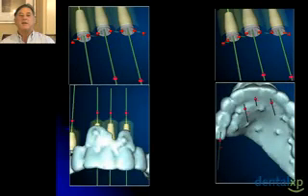In the lower left, you see 3 implants well positioned in these 3 anterior teeth. If we look at the palatal view where they would emerge, the central implant looks reasonable. The other 2 look like they may not be in ideal positions. So again, we're trying to plan things in 3 dimensions.